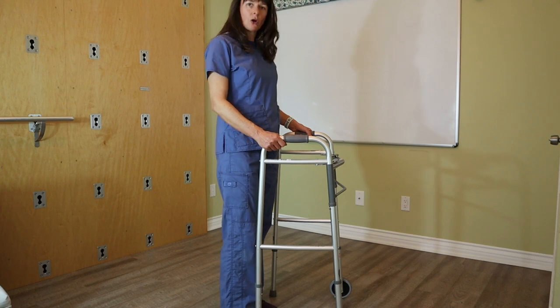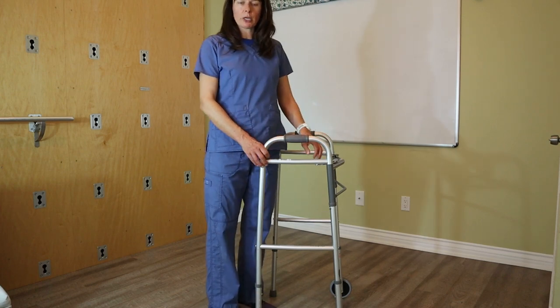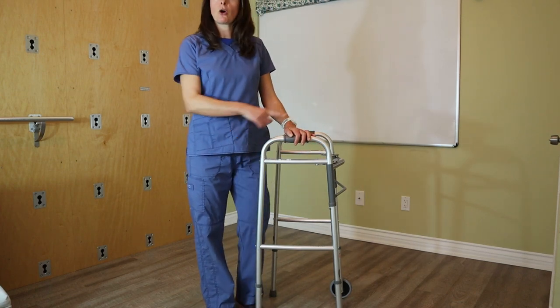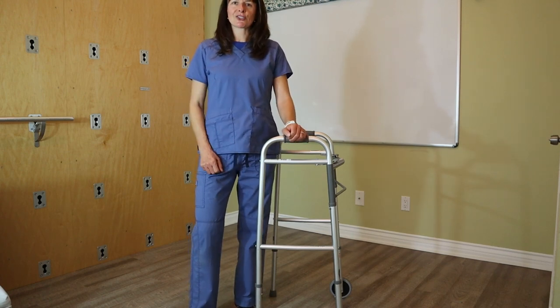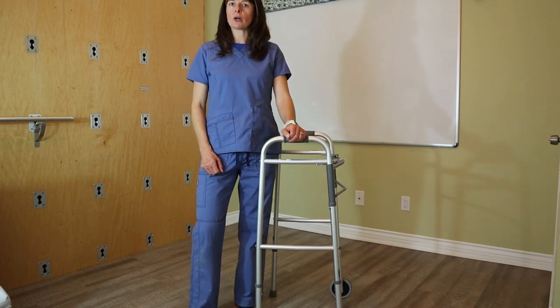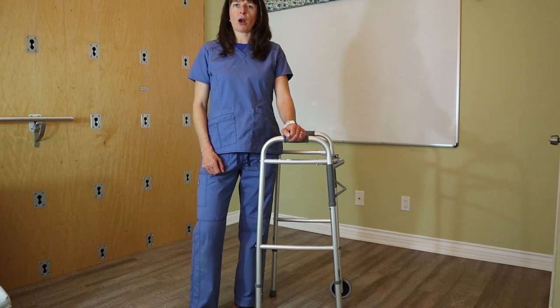The legs of the walker — all four — are adjustable, so make sure you adjust all four legs to the same height, otherwise it's going to wobble. Please also check out the other video where I go into how to walk with the use of a walker.